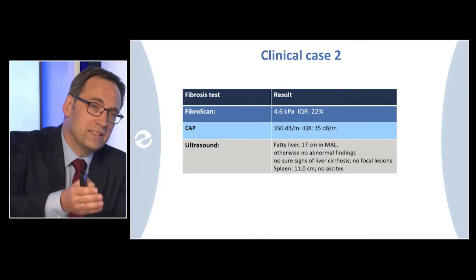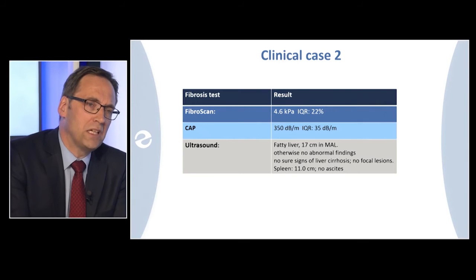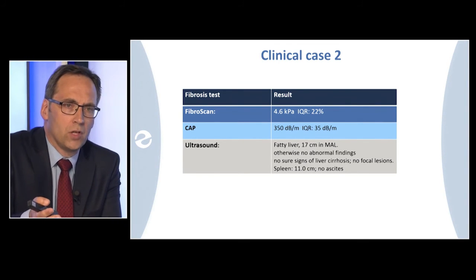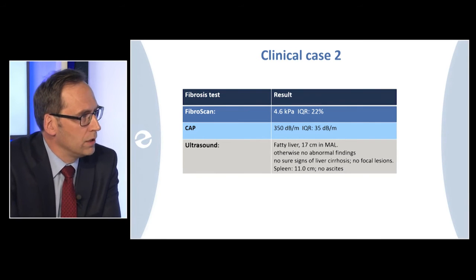So in this patient, it would be a nice marker to follow up, because the stiffness is normal and the transaminases were almost normal. So at least you can tell the patient, yes, you improved metabolic load. And of course, we would rule out any fibrosis here, so the patient can be safe.